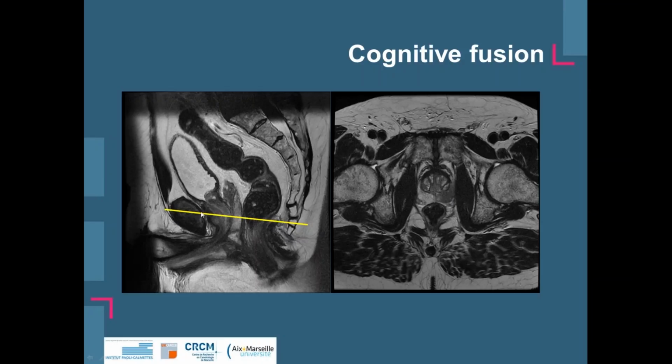and be careful on the sections you might have in the actual sections here. They need to be perpendicular to the posterior wall of the prostate in order to simulate the sections you can get with the ultrasound probe, either an end-fire probe or a side-fire probe. Sometimes they are really oblique, and in such cases a lesion that is shown here at the posterior side will be in fact, if it's shown at the anterior side, at the apex and no more at the mid part. So this is an important information.